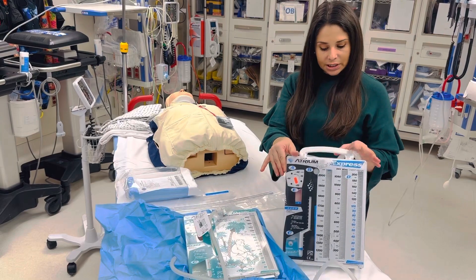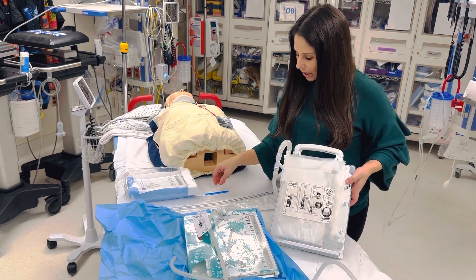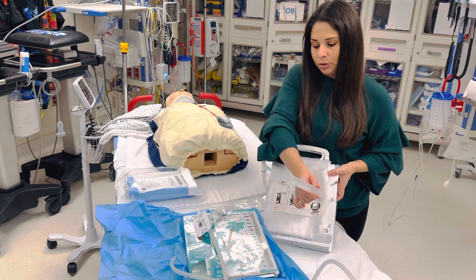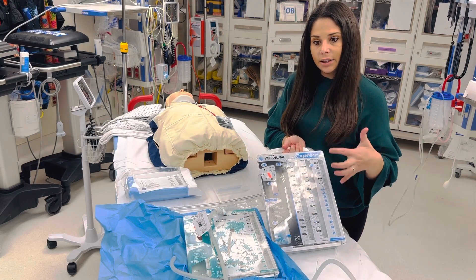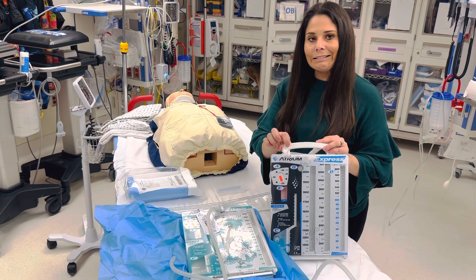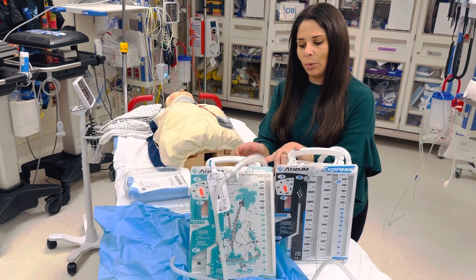Dry seal chest tubes are a little bit different. There are instructions on the back, and there will be a syringe for you. You take that syringe — it's a luer lock this time — and inject the water in through the back of the chest tube. When you do that, the water fills up down here. So dry seal is through the back, and the water seal is through your suction port. The way I remember that is the dry seal port is white for not having water through there, and the water seal is blue because you're putting water through there.